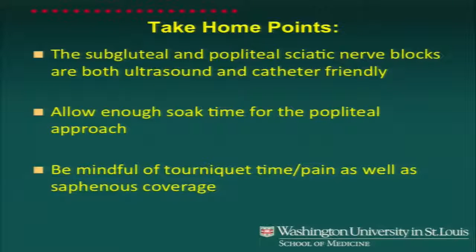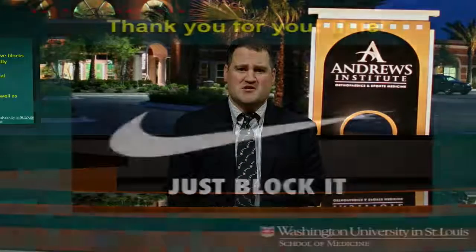You need to be mindful of the tourniquet time and pain, as well as remembering to block the saphenous in order to ensure complete lower leg neural blockade for any of your lower extremity procedures.